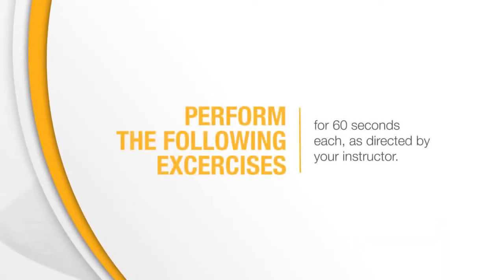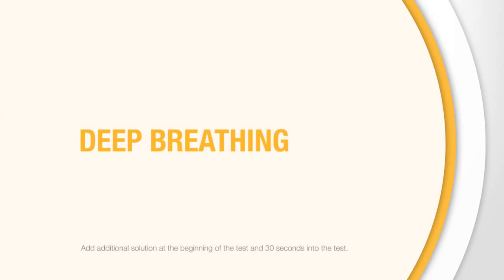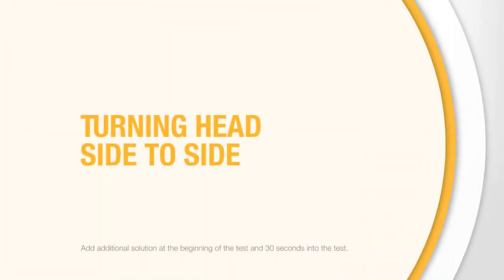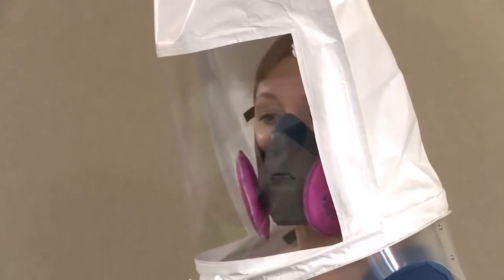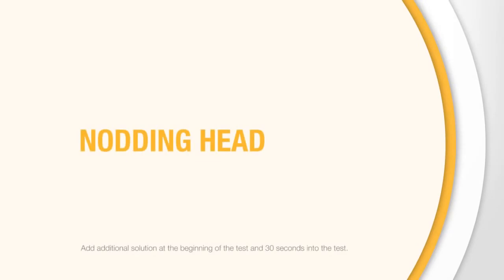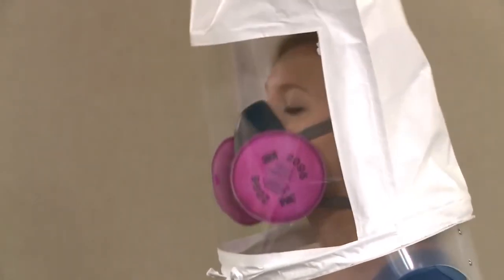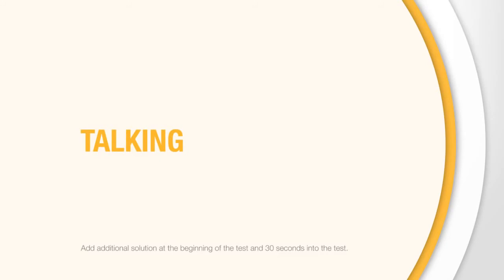Perform the following exercises for 60 seconds each as directed by your instructor. 1. Breathe normally. 2. Breathe deeply and regularly. 3. Turn your head from side to side, stopping for a breath at each side. 4. Nod your head up and down, holding at each position for 1 or 2 breaths. 5. Talk. Read the rainbow passage slowly out loud.